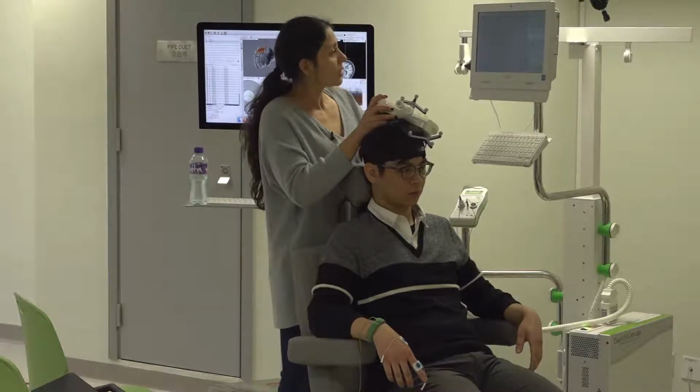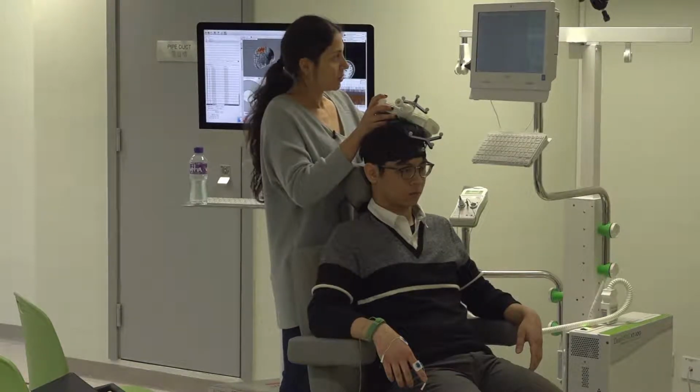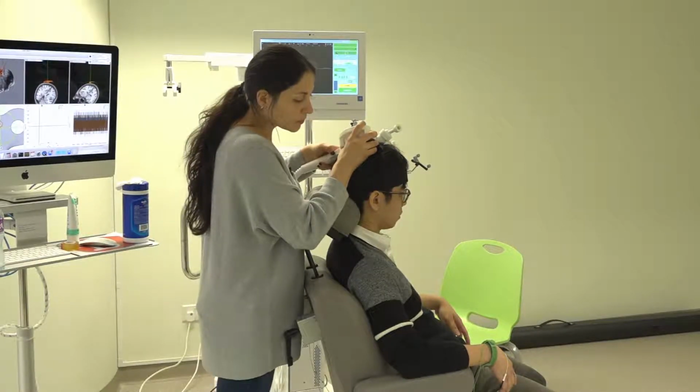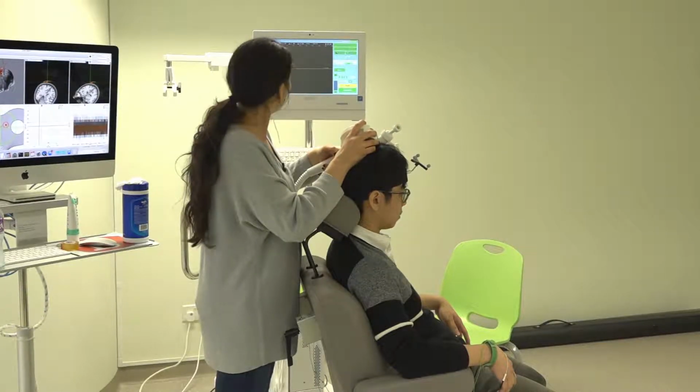So sometimes I'm getting it, sometimes I'm not. So it's not stable, because no, I get it.